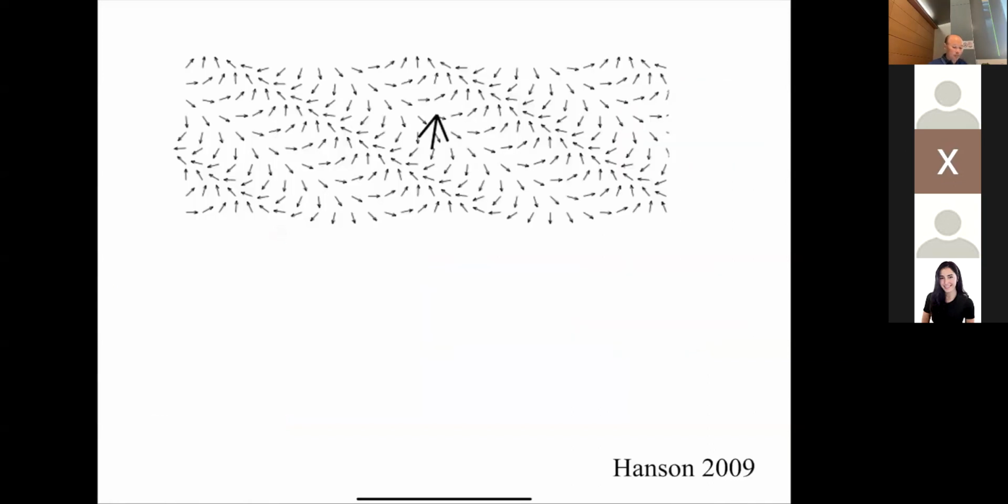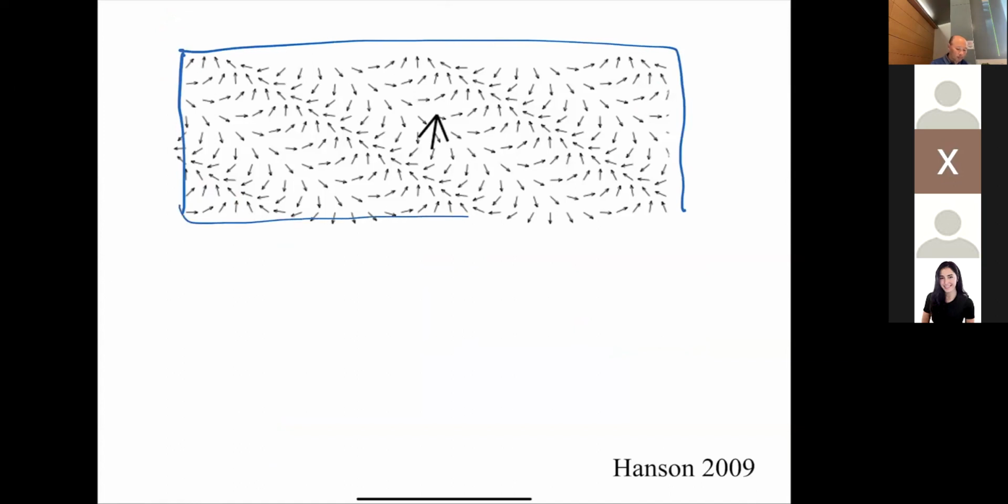Let's talk a little bit about what happens when I integrate all the spins and how that spatial pattern is related to the value of the Fourier transform. Let's imagine this is my object. Let's say it's a piece of chocolate that has enough water in it that there are enough proton spins that we can detect. So I impose a spatial pattern like this, a diagonal pattern. So I'm at some point in kx, ky.